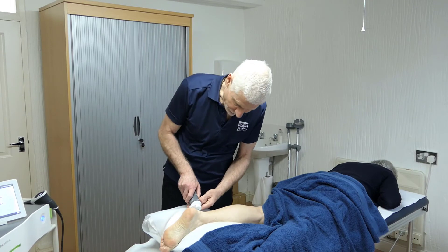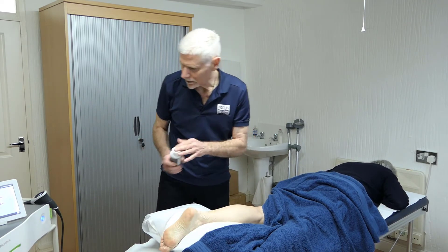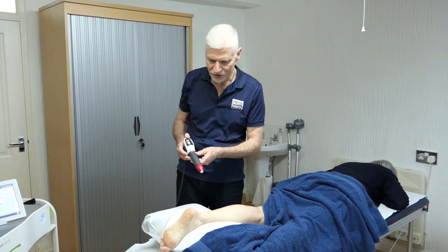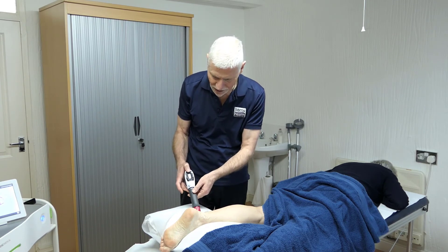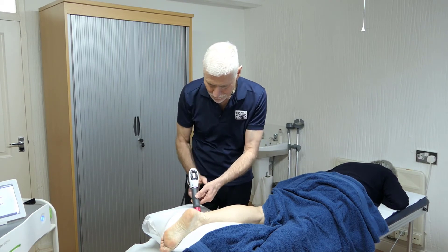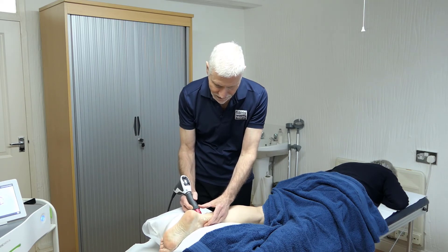The gel is just our coupling medium, so it doesn't have any medication in it. Starting with low pressure and high frequency for a numbing effect, I spread the gel on the skin. I hold the unit low down — there's a rubber clasp here to hold the unit — and I support the patient's leg. You can hear it quite fast to start with. I'm lifting and lowering the machine, and you can hear the sound fading as I do so.